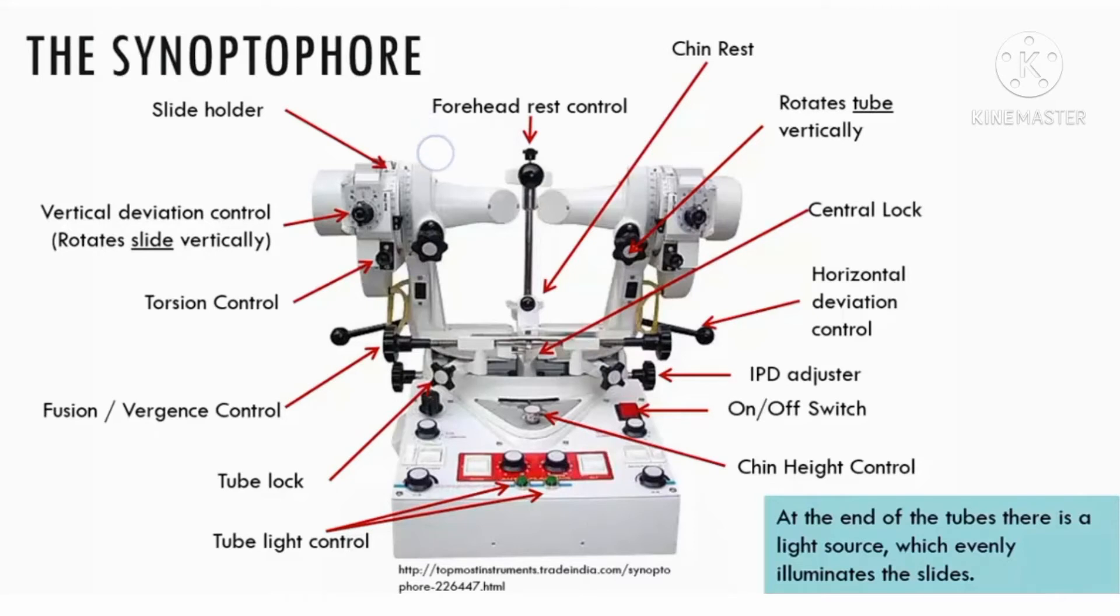Next is forehead rest control, which is used for adjusting the position of patient's forehead. Next is chin rest. Next is on/off switch for turning synaptophore on and off.